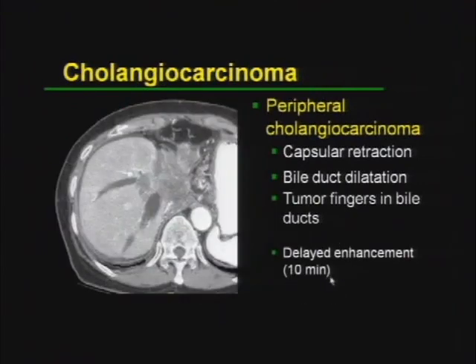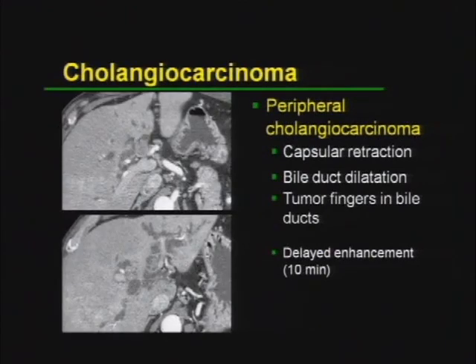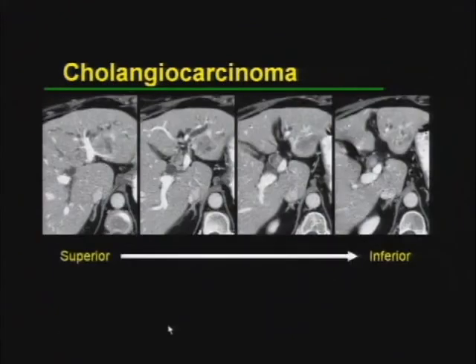Cholangiocarcinoma may also have delayed enhancement. Here's an example: a large mass with dilated bile ducts — if you see dilated bile ducts, immediately think cholangiocarcinoma as a possibility — along with retraction of the liver capsule. Here's another example of a little mass in the liver hilum with quite a lot of bile duct obstruction and dilatation; we don't usually see that with colon cancer mets or HCC. We can see a finger extending through the bile ducts. Another example shows a mass in the left and right lobes of the liver with a finger of tumor extending down the common bile duct — very typical of a cholangiocarcinoma.